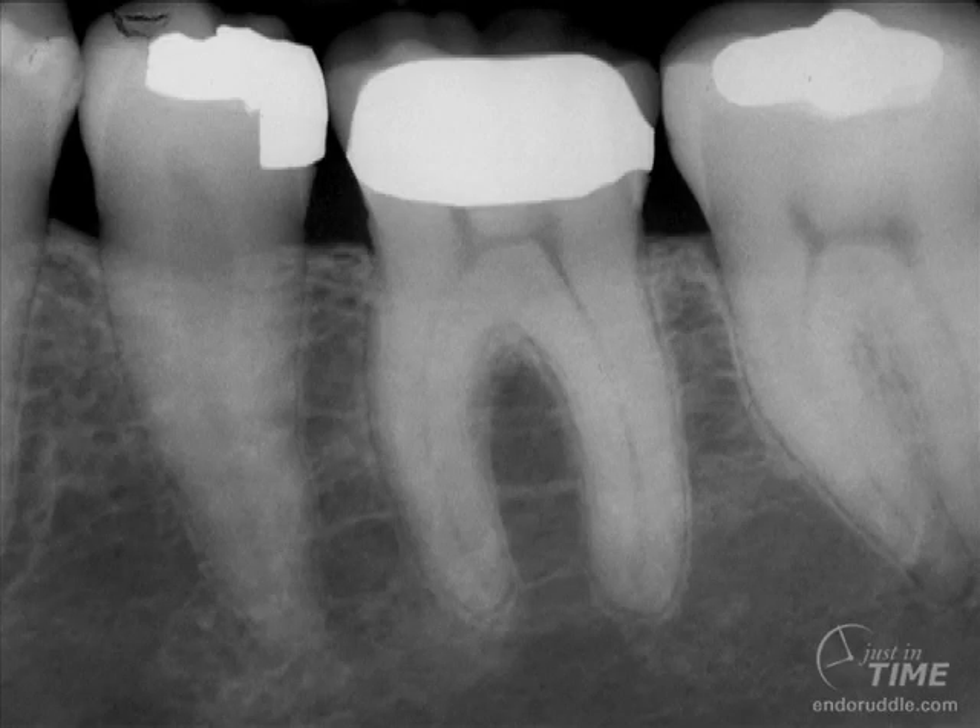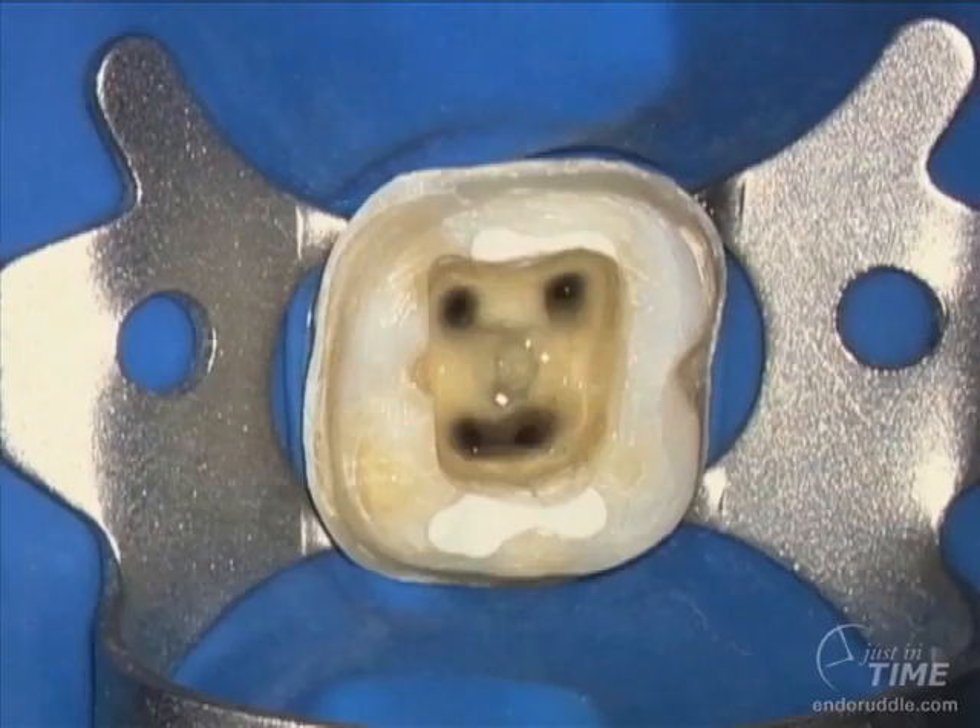Previously in other segments, we've demonstrated how to take off the clinical crown intact. We've shown access preparation, glide path management, shaping, and disinfection. In this segment, I'd like to emphasize and illustrate the warm gutta percha with vertical condensation technique in the mesial root.